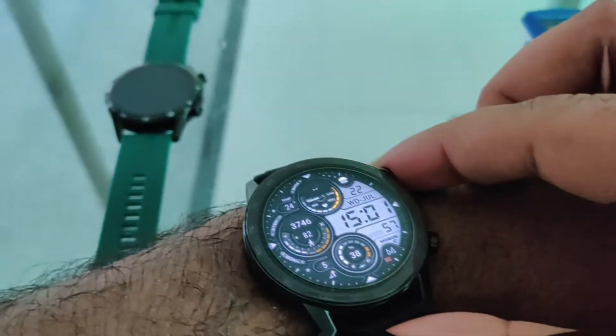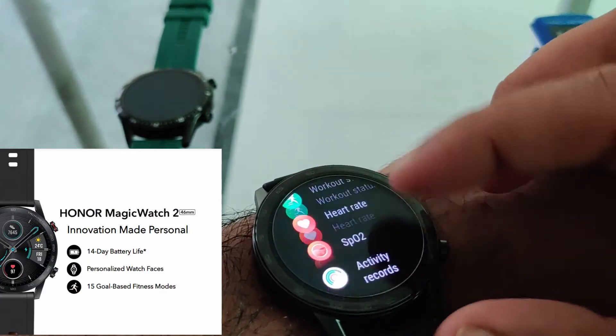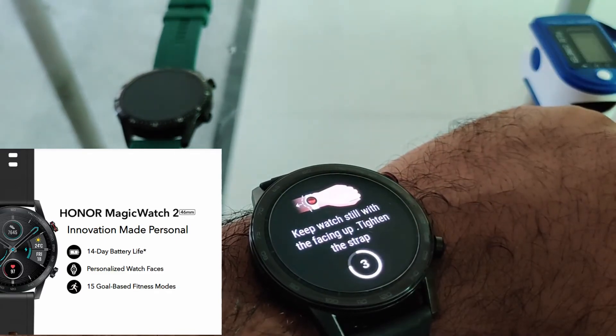Moving on to the third one, that is the Honor Magic Watch 2 — let's quickly look into it. Let's quickly navigate to the SpO2 levels, very similar to that of the GT2.